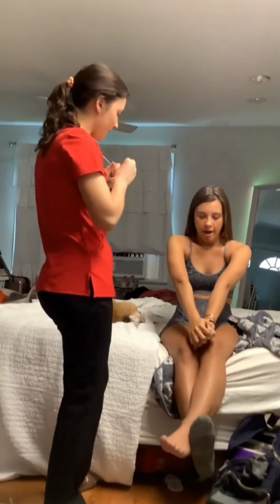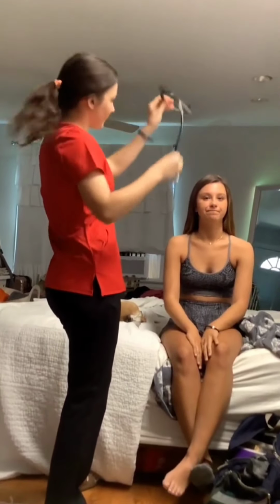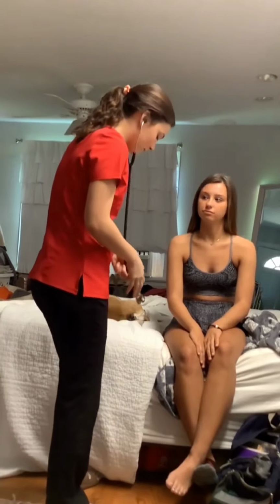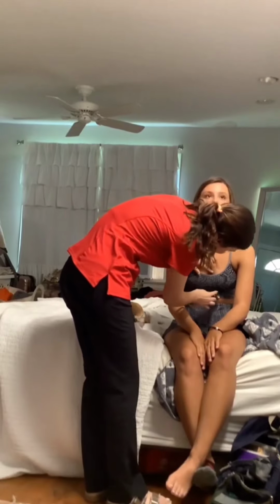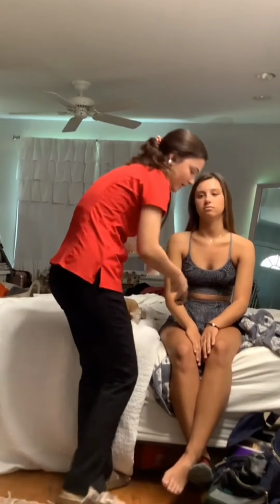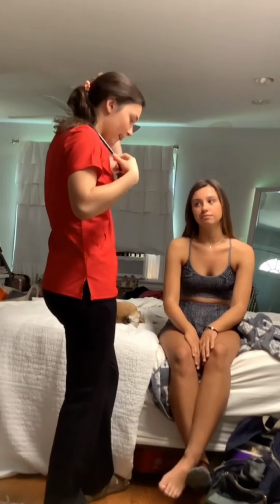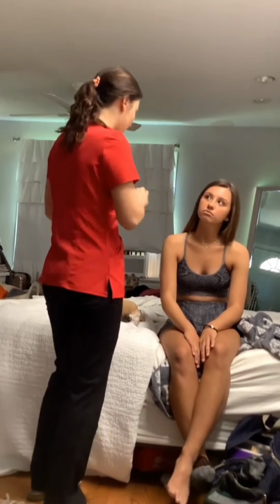And I'm going to go ahead and clean my stethoscope again. And I'm going to listen to the apical impulse in the 5th intercostal space, medial to the midclavicular line. I'm going to listen for an entire minute, and I would hear 60 to 100 beats per minute, and I heard a short, gentle tap. Now I'm going to listen to the rest of the areas of your heart.